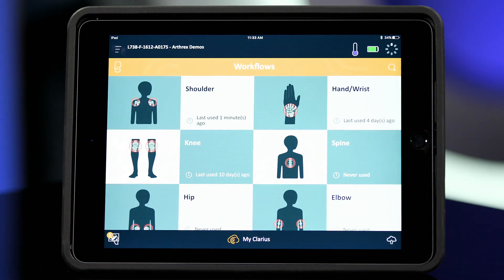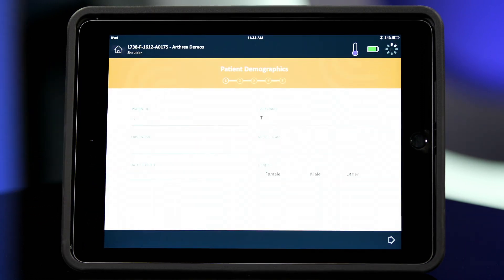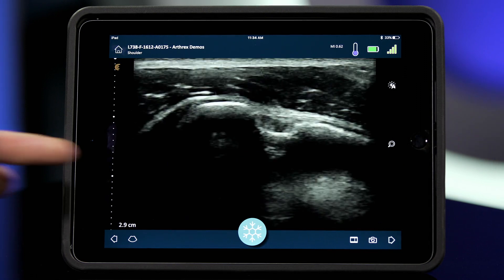Once registered, easily select your scanner to launch its local wireless hub for a secure direct connection with your mobile device.